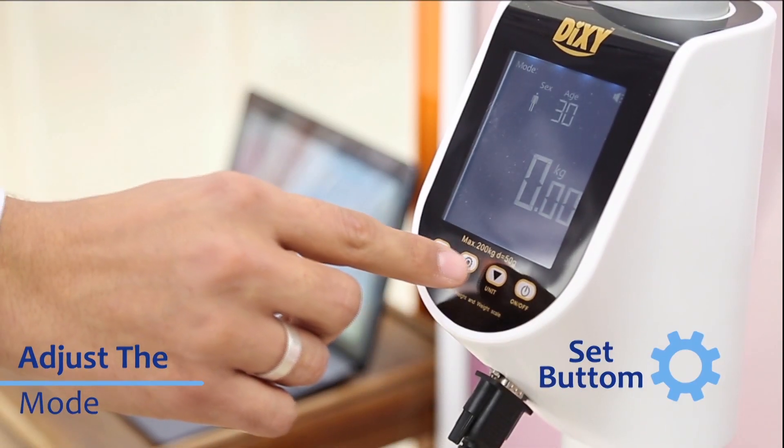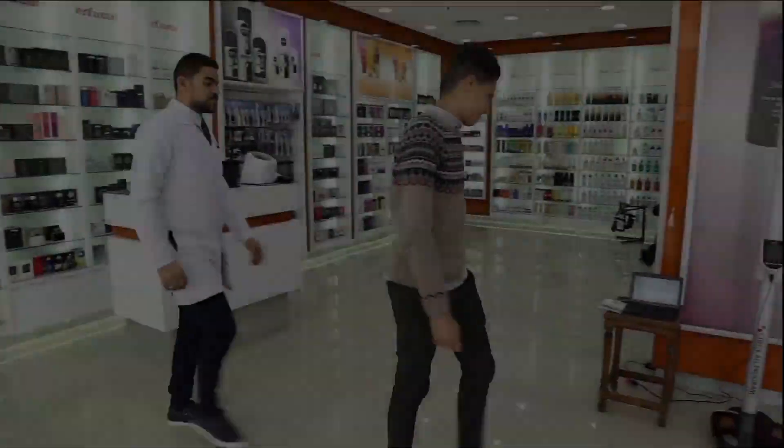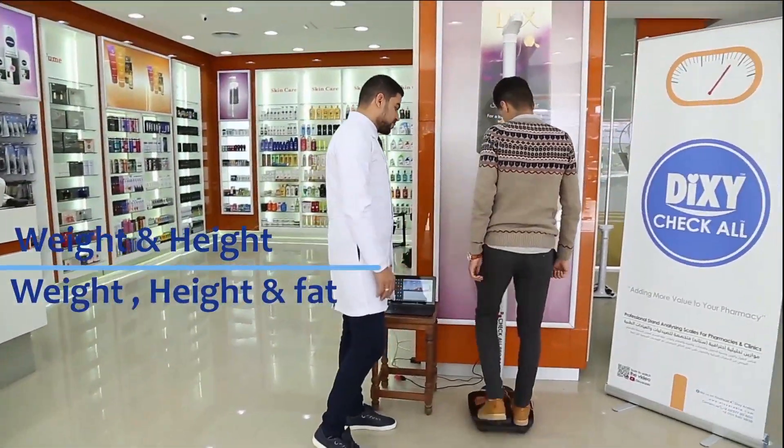Adjust the mode from the Set button. You can choose one of two modes: Weight and Height, or Weight, Height and Fat mode.